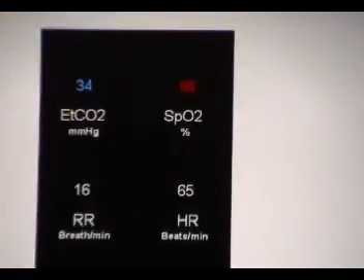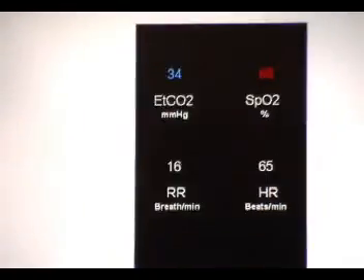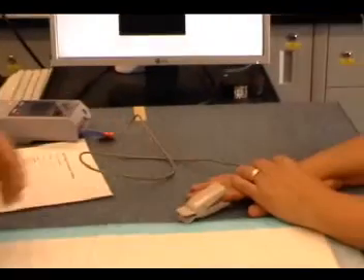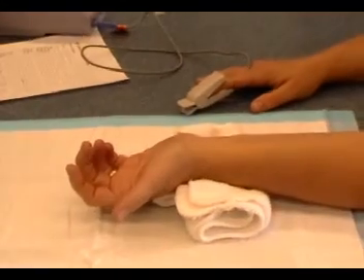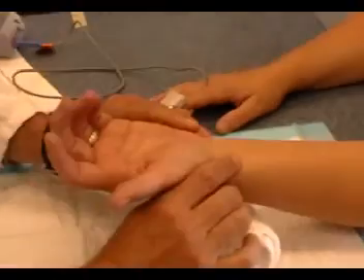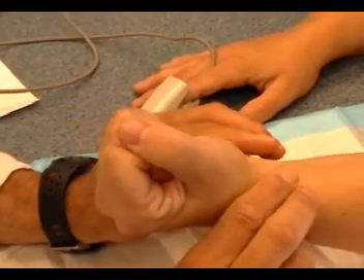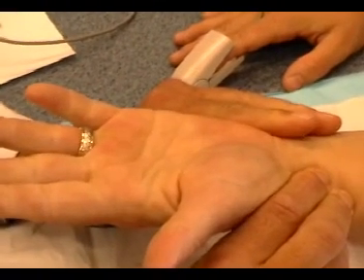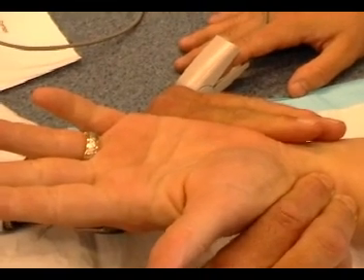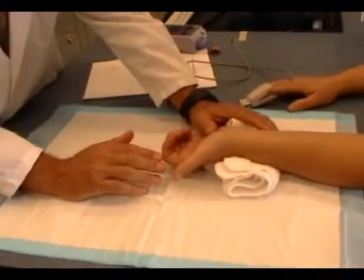It's been 20 minutes and I'm back now. I've noticed that your saturations are down a little bit, but that's okay — we're going to do the blood gas on room air. I'm going to use your left hand. So I'm going to do a little test we call an Allen's test. What I'm going to do is confirm that you have good circulation in your hand. So I'm going to apply a little bit of pressure — can you make a tight fist for me? Now open it up. Okay, it's nicely blanched. One, two, three, four, five, six. You've got good circulation to that hand. I'm going to perform the blood gas on this arm.